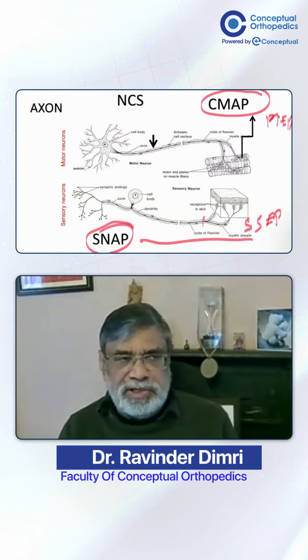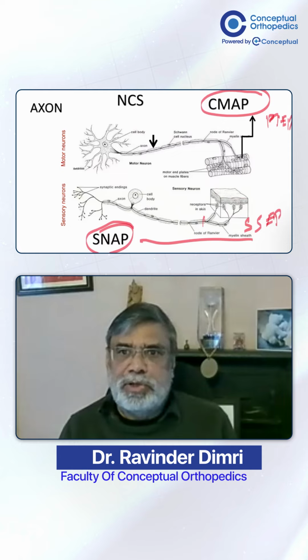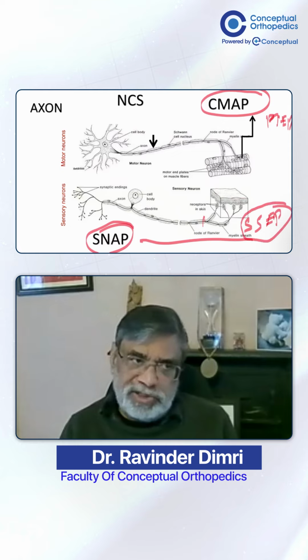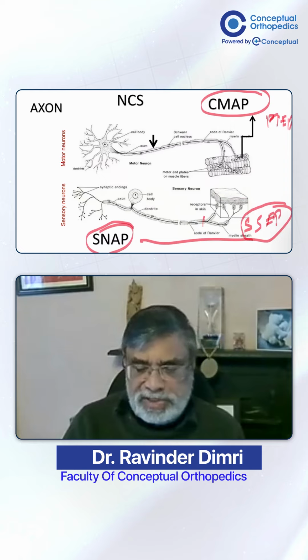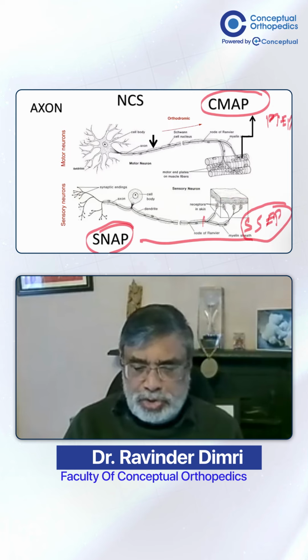If you're doing visual, for the eye, you want to check, then it's called visual evoked potential. If you want to do hearing, you will call it auditory evoked potential. But since we normally do the skin, we call that somatosensory evoked potential. Although you can do it for vision, for hearing, and for other things for cranial nerves, we mainly do it for skin. So we're doing somatosensory evoked potential and motor evoked potential. Just remember these two things.